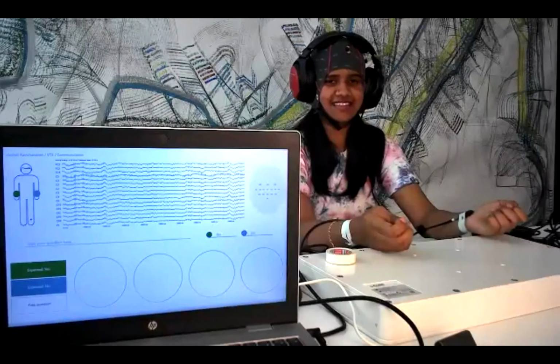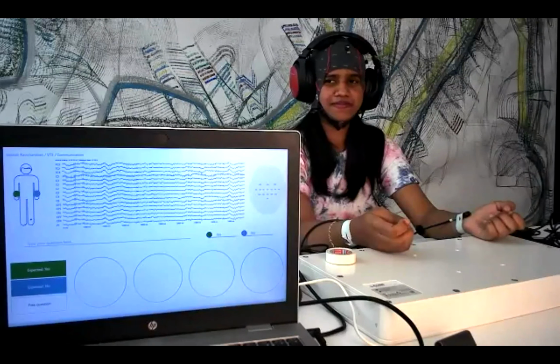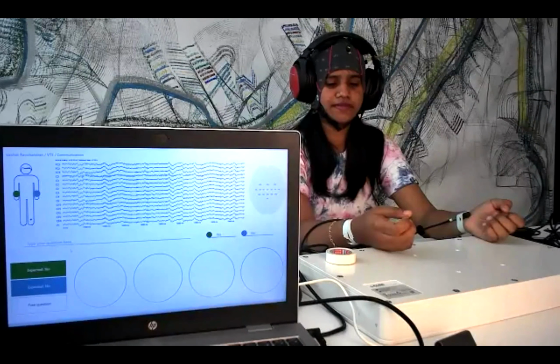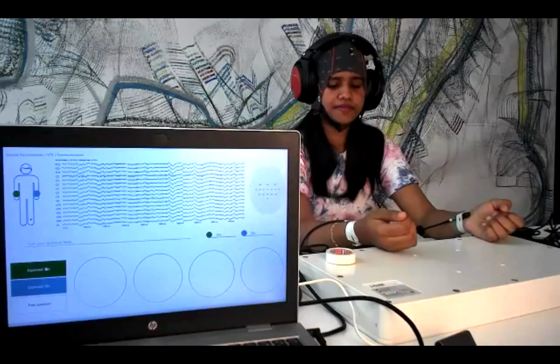Yeah, I would assume you're answering yes. So if that's the case, you should focus on the right wrist. That's the yes. And we can start. Ready? So count on the right, and let's go.